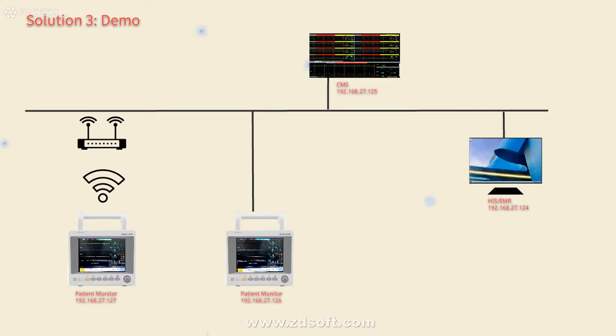Our hardwired cable monitor is 192.168.27.126. Our CMS software is 192.168.27.125. And our HIS EMR software is 192.168.27.124.